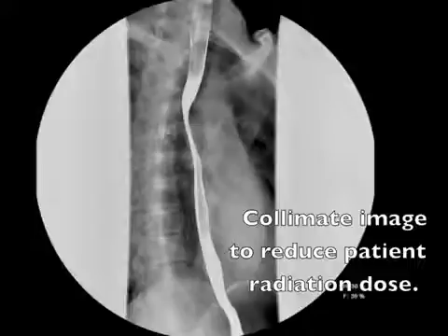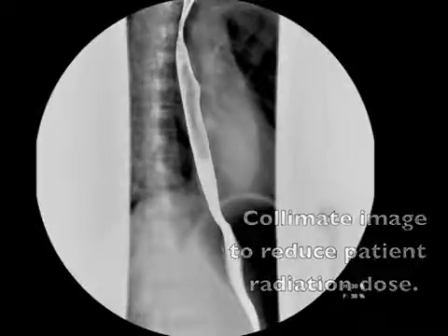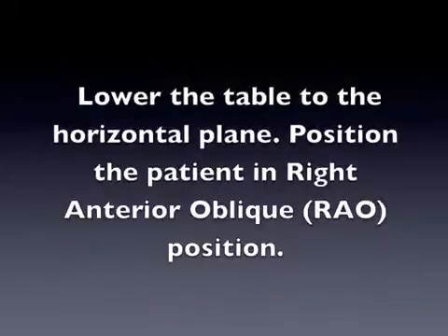To reduce the patient overall dose, collimate the image to a narrower field, visualizing mainly the esophagus. Lower the table to the horizontal plane.